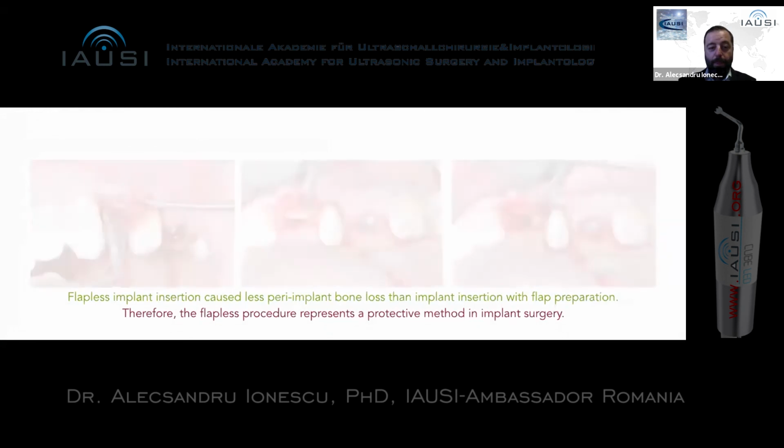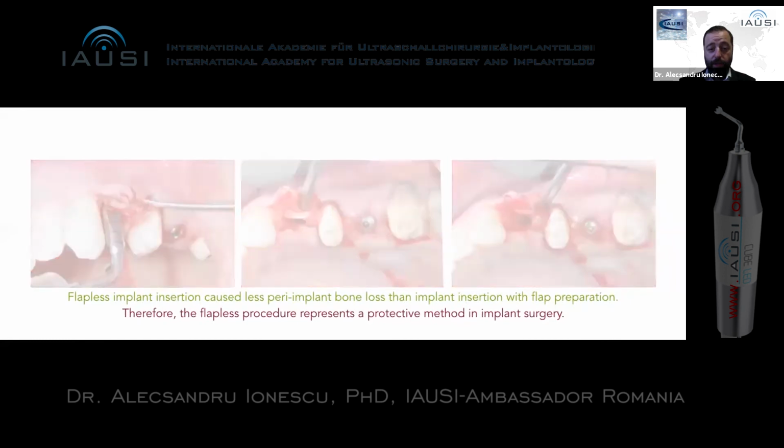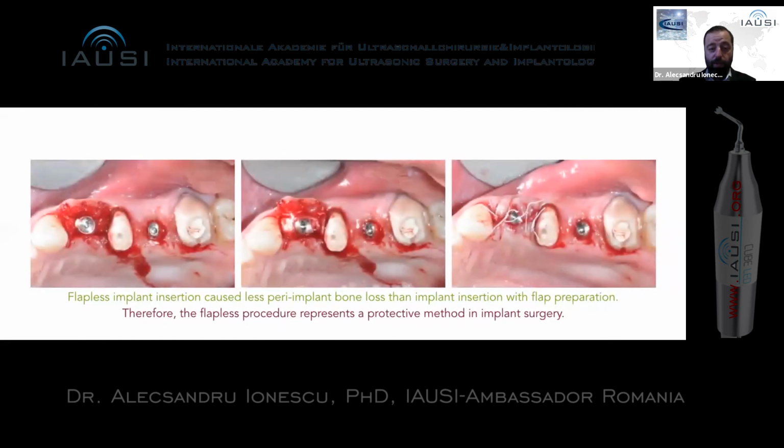And then we proceeded with a minimally invasive bone split. It's very, very difficult when you do it in such a narrow crest, when you only have space for one implant. And you can see the other one went straight forward with the internal sinus lifting. And you can see the buccal plate, how we moved it more buccally, and then we used the surgical guide for the implant positioning.